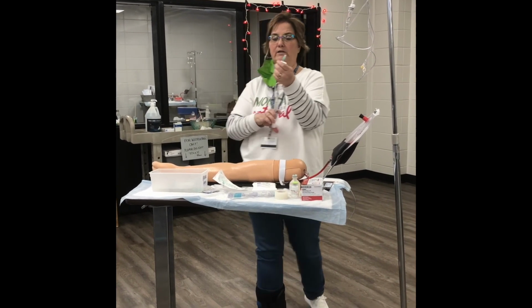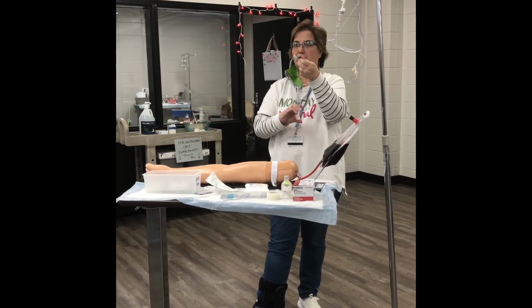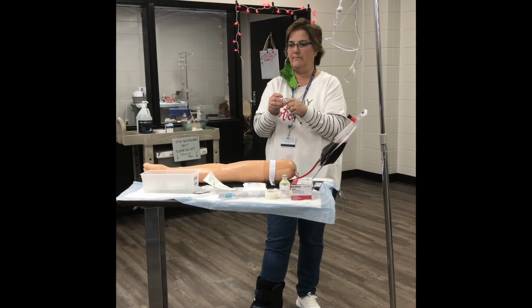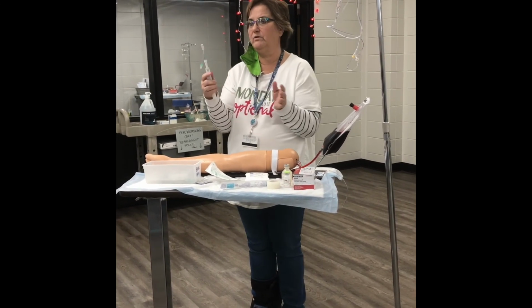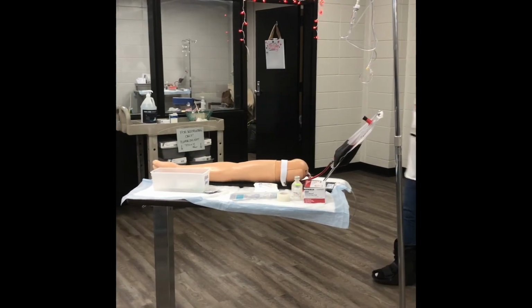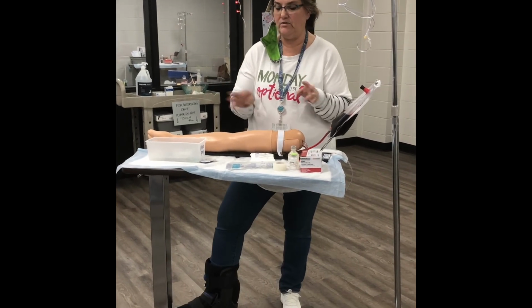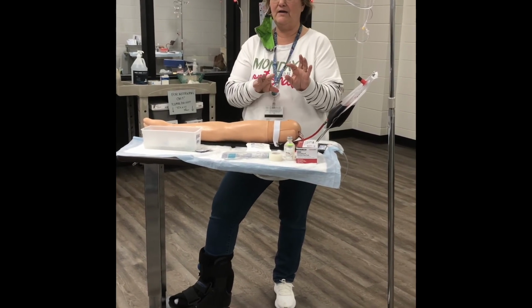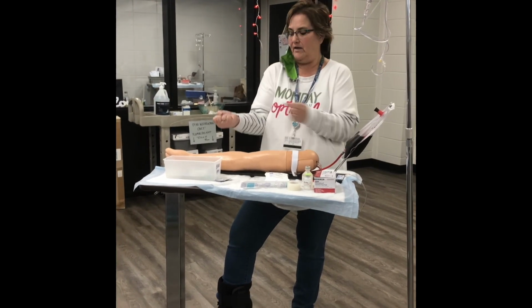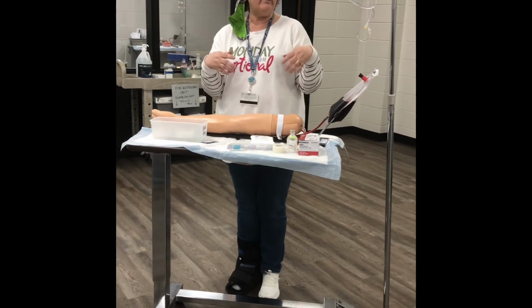All right, hold it upside down. You just want to put enough through till it comes out the end a little bit like that. You can leave that hooked up. Go ahead and clamp that off, but this can go to the room with you just like this. We are not trying to see if it works, we're just trying to get the air out. One of the reasons we do this in the nurse's station, if you have time, if it's not an emergency, is because when you start handling needles and IV lines and stuff, it makes people nervous and they get scared. And when they get scared, they hold their arm like this, and it's harder to stick when they're all tensed up, all right? So we're ready to go to our patient's room.